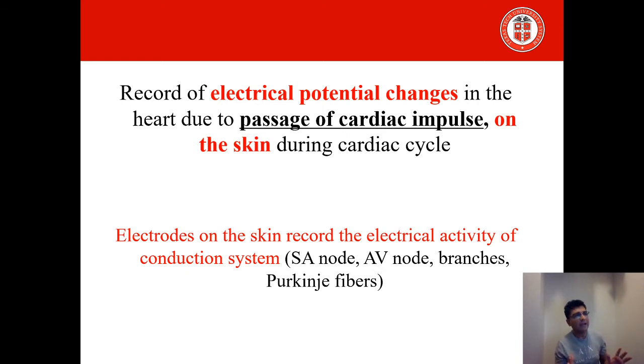I always want to highlight and let everybody know two big things whenever I am teaching ECG. The first thing is that ECG is the recording of the electrical activity of the heart. It is not the mechanical recording, which means that when our heart is pumping blood, that is not what is recorded. Once the electrical impulse passes through the conductive tissue of the heart, then the changes which are taking place, if we are recording those changes on the surface of the skin by putting electrodes, that recording is technically known as ECG.